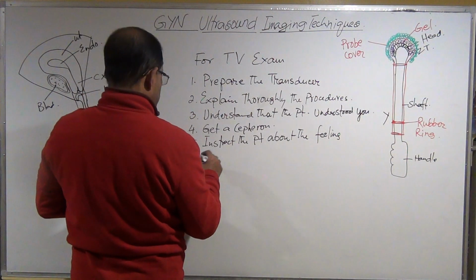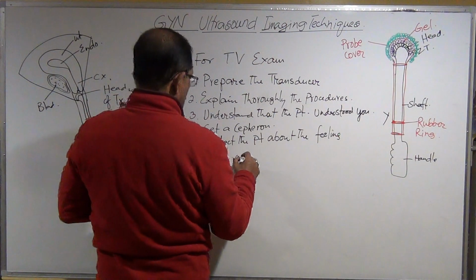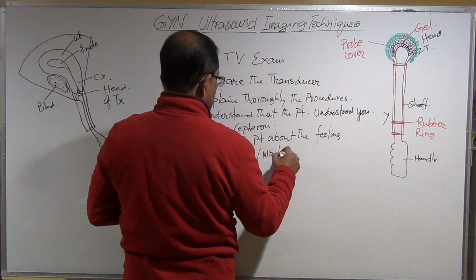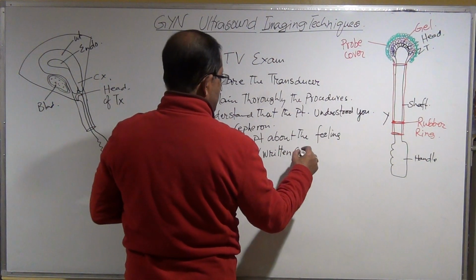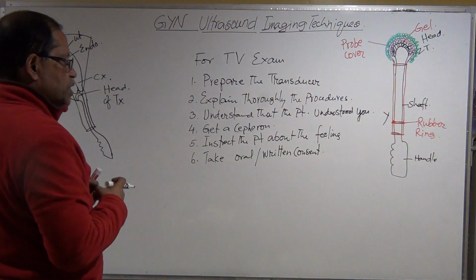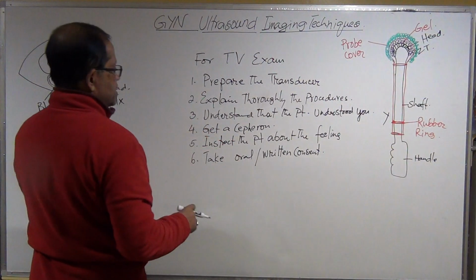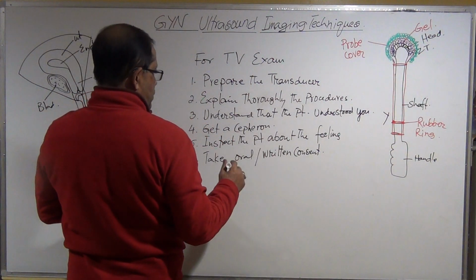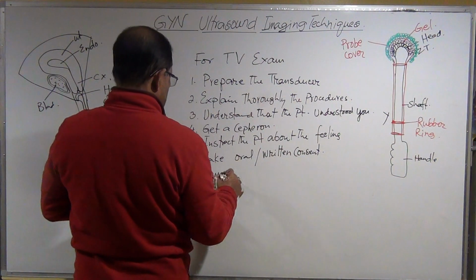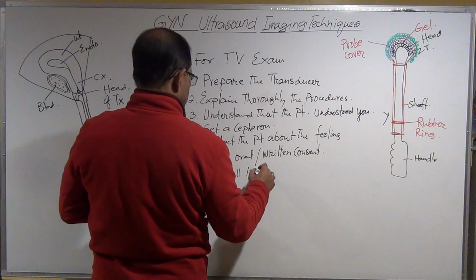And make sure to take oral or written consent. Okay, make sure you do it. You will be free from anxiety. Okay, when it is done, save all images.